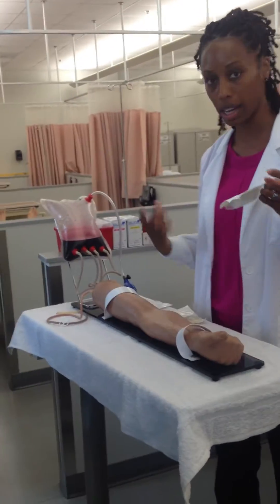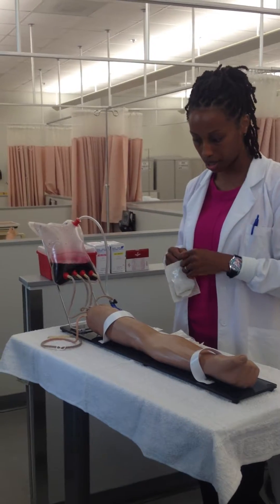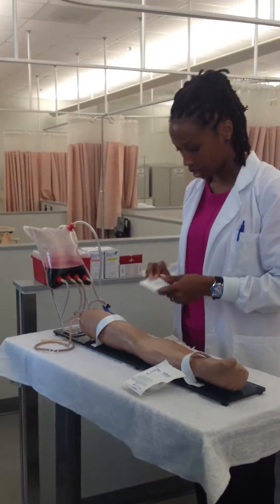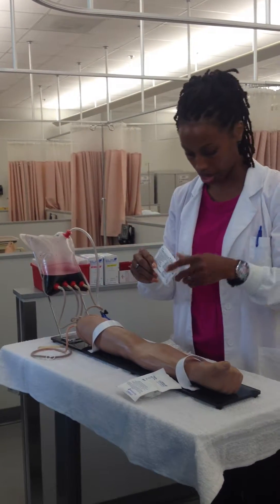What you'll see me do in the hospital: if you need an IV site, a patient just got in, or you need a new IV, you're going to get all the supplies. We always use an IV start kit. Then we can get an extension tubing — this is what adds some length to the actual IV.